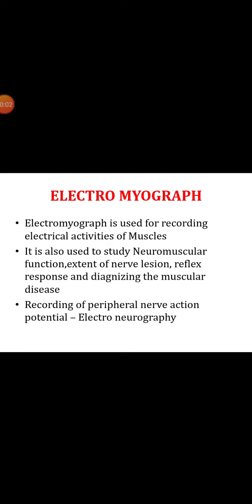Welcome to this presentation. In this module, let us have an insight of EMG and PCG. The EMG, that is electromyograph, is an instrument used for recording the electrical activity of the muscles to determine whether the muscle is contracting or not, or for displaying on the CRO and loudspeaker.